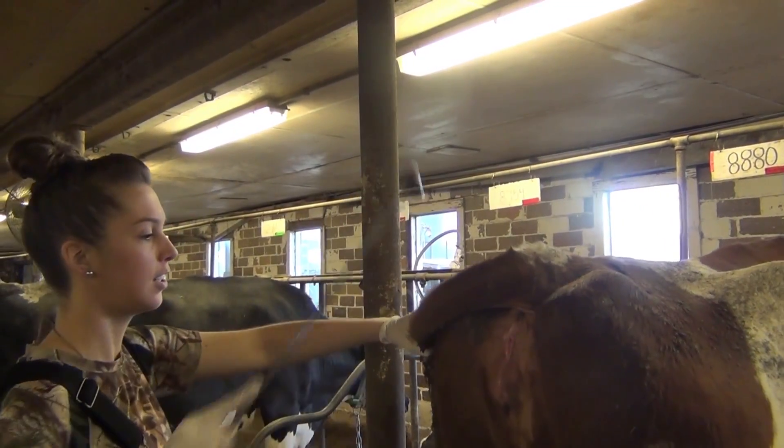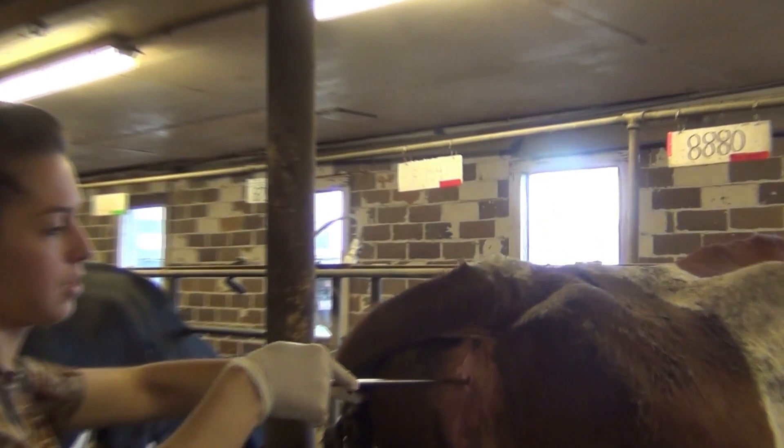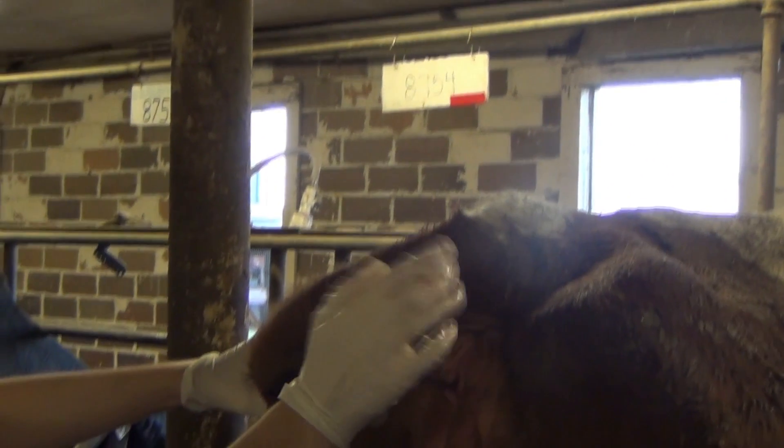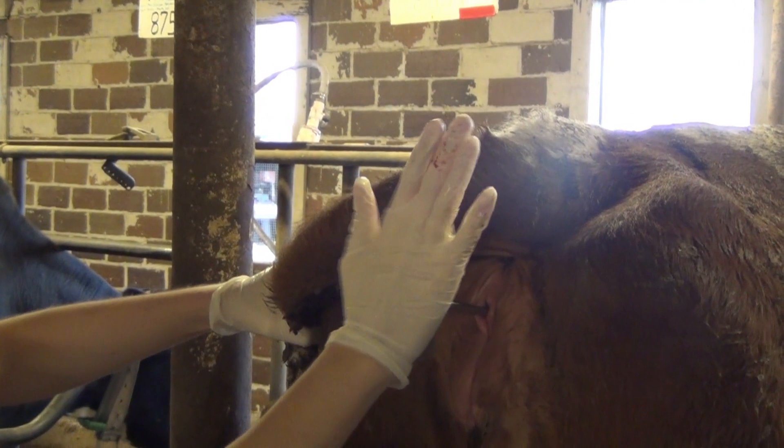From here, grab the MetroTech device from the hand holding the tail and slowly insert it into the vagina of the cow at an upward 45 degree angle. You want to push the MetroTech device all the way into the vagina until it stops. This stopping point means that you have pushed the device all the way up to the cervix of the cow.